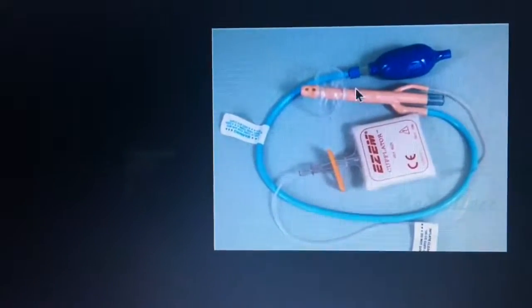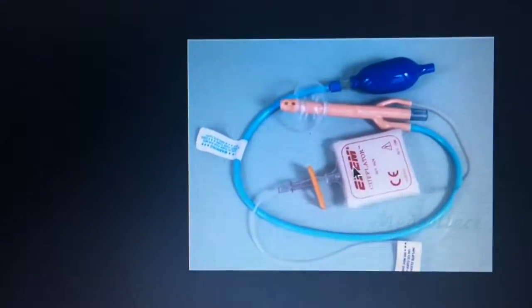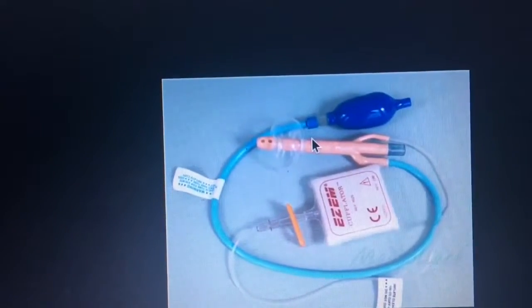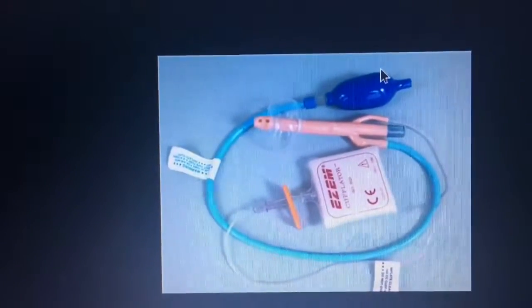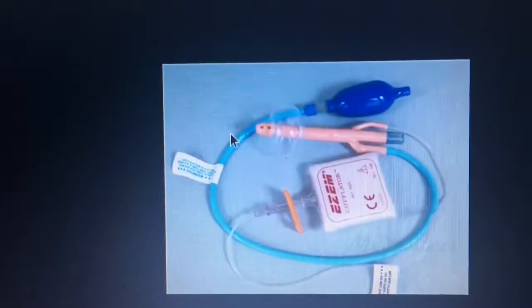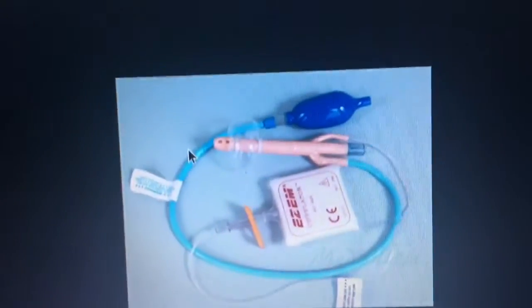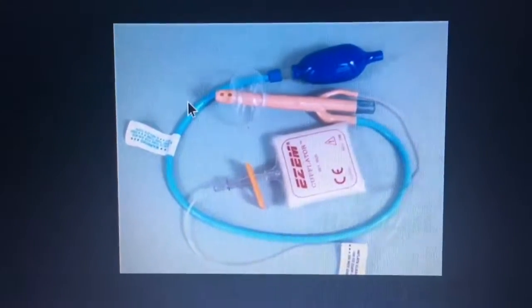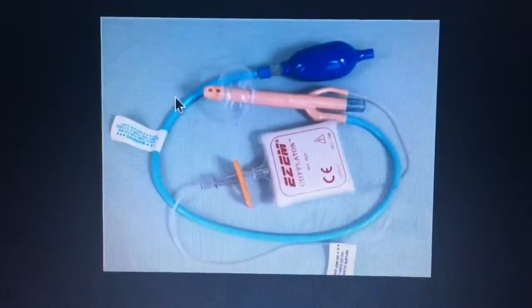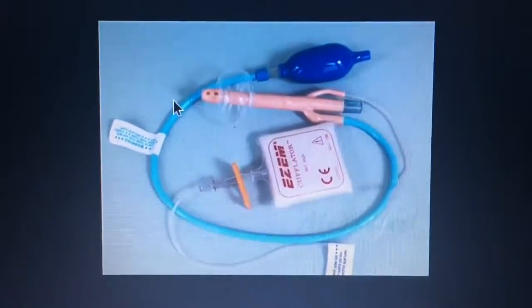I told him that we'd be inserting this tip, inflating this balloon once it was in there to anchor it down by applying 1 squeeze of air, and then once the radiologist was in, the radiologist would further pump more air using this bulb into the rectum to dilate the large intestine so that we can use it as a double contrast exam, so that we can see all of the intestine. We also instructed the patient that we'll be retrofilling the colon with barium.